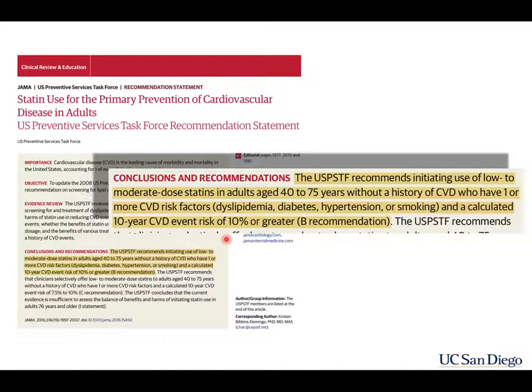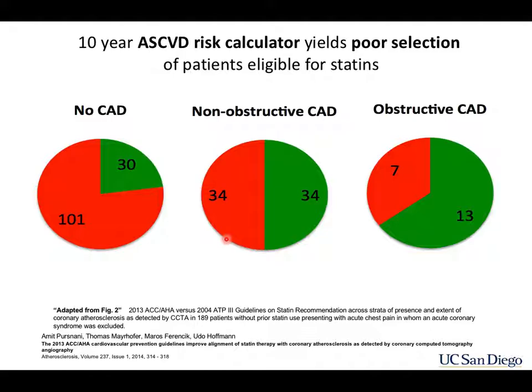So you do that clinical thing. Now we have this non-invasive technique to look at people's coronary vessels and ask how well does this ASCVD risk calculator, a non-imaging technique, stack up to predicting whether or not a person has cardiovascular disease at all? This is a really interesting paper.